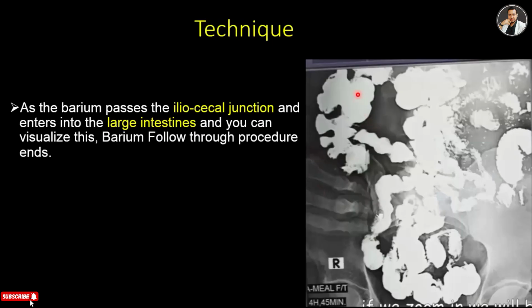So here I zoom in on the ileocecal junction. As the barium passes the ileocecal junction and enters the large intestine, you can visualize this, and the barium follow through procedure ends. That means when the contrast passes the ileocecal junction and enters the large intestine, your study is finished.